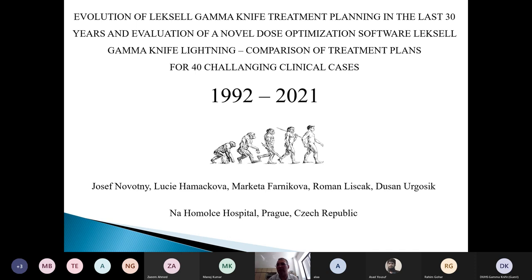If you know that you will be getting over 200 intracranial cases per year, would be my reasonable guess. But of course, this is also a medical question and maybe an administrative question as well, depending on how much pay you get per treatment and so on. I think Gamma Knife is superior. It's a very elegant system. Never, at least in my life, I'm not saying it's not possible, but it's probably very hard to treat 6-7 patients per day, with patients coming in the morning at 7 and by 3 o'clock they're going home. They are done. All procedures are done for those patients.